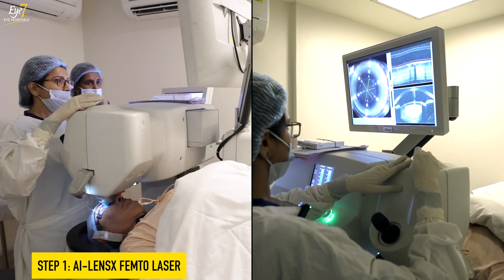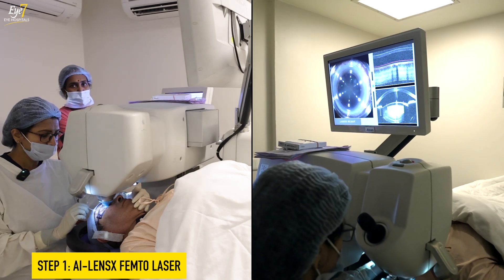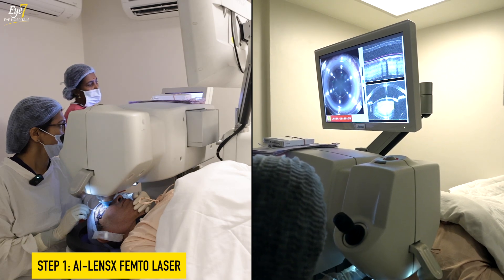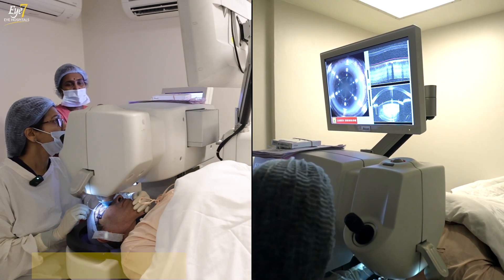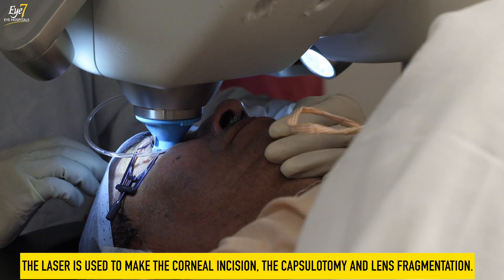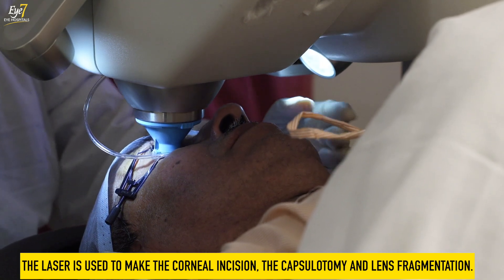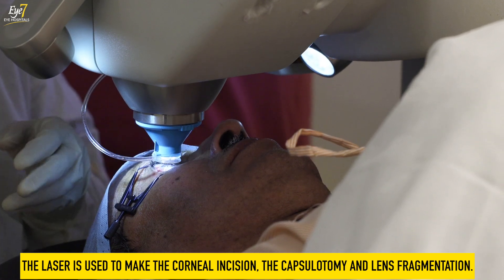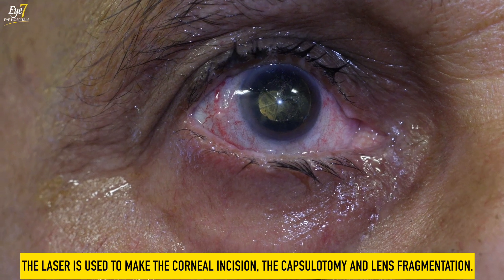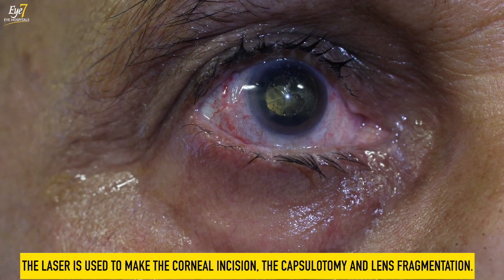The laser takes about 20 to 25 seconds. We press the switch button and the laser starts firing. In the next 20 seconds or so, all the steps — the corneal incisions, the capsulotomy, and the lens fragmentation — are completed. The patient doesn't experience any kind of discomfort or pain during these steps. With femto laser, all these steps are done in 20 seconds.